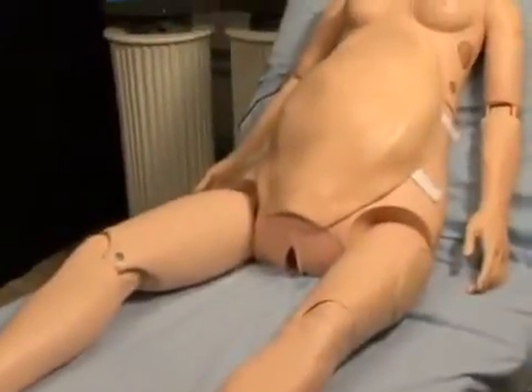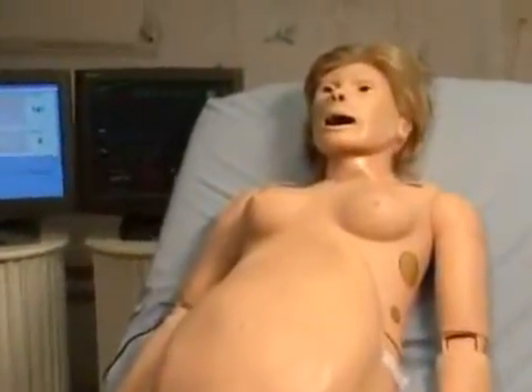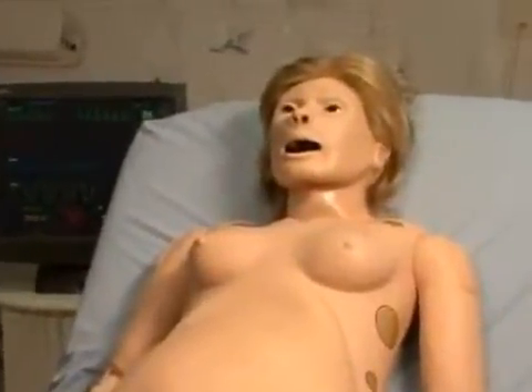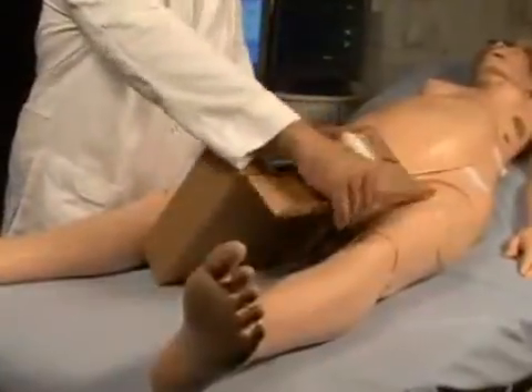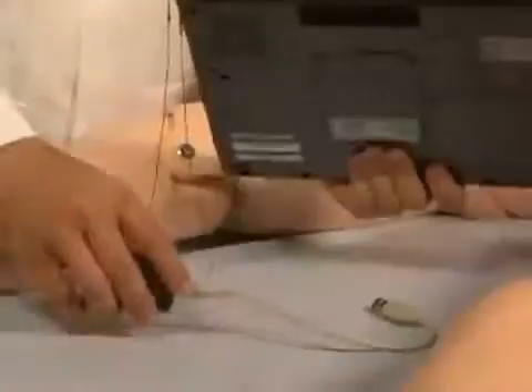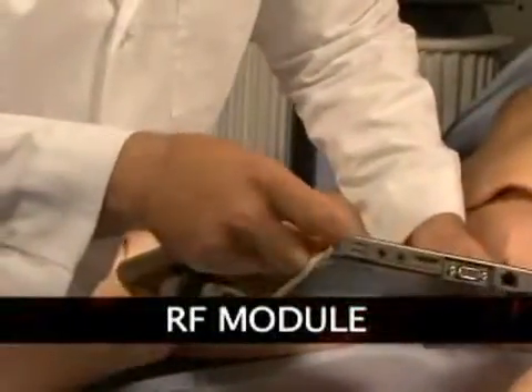The first task following the arrival of your new NOEL simulator is to ensure you have received all of the equipment and accessories. Remove the tablet computer, which is packaged separately, and connect the RF module to either one of the USB ports on the left side of the tablet.